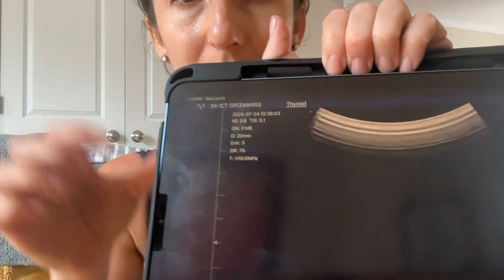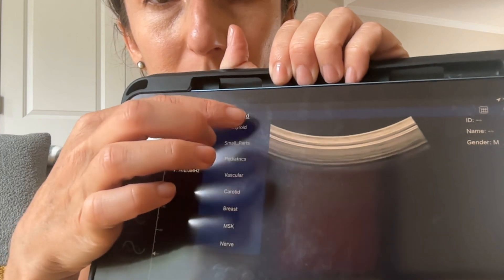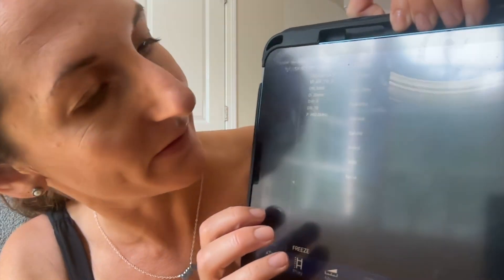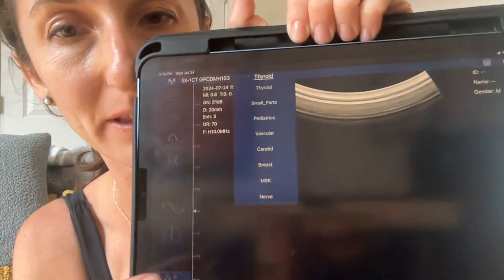If you press the center button and hold it, I've now switched to the linear probe, and you can see on my app I have different options that are more small body parts. With the linear probe, we can look at thyroid, pediatrics, vascular, carotid, breast, musculoskeletal, and nerve. We'll play around with this one first.